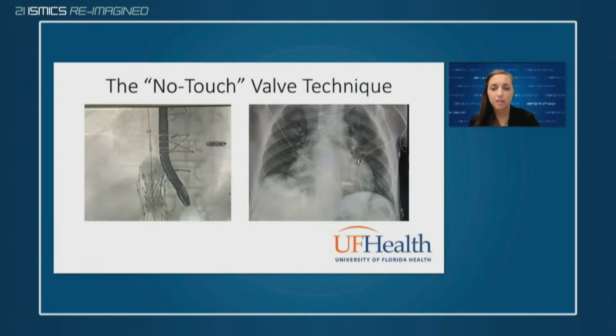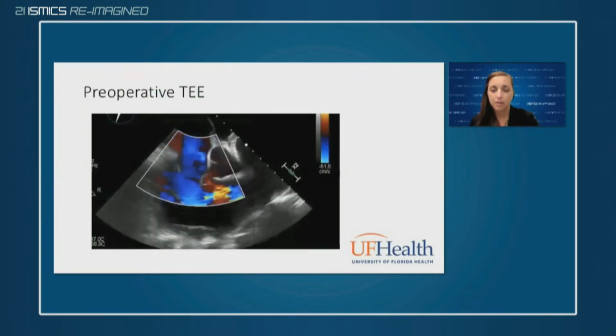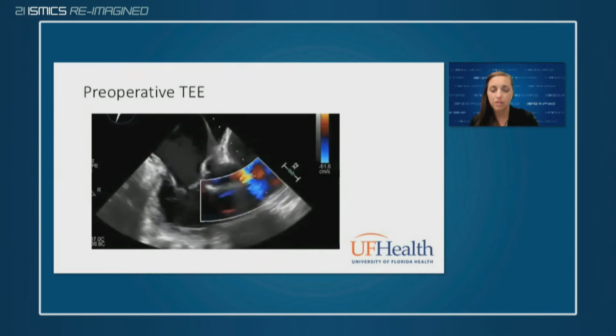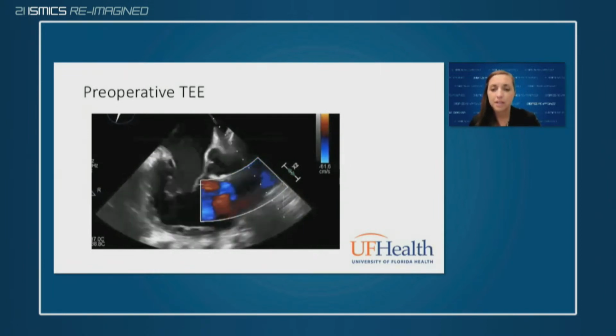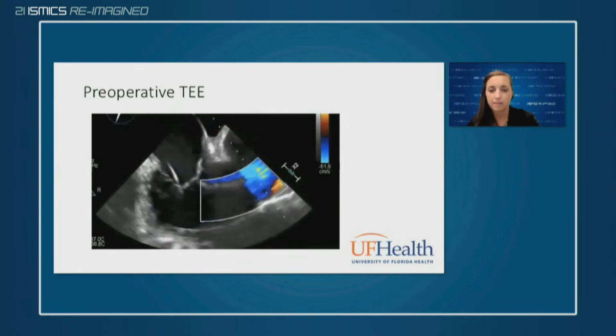The patients described underwent staged procedures, replacing the intracardiac leads with a microleadless pacemaker within the RV, as well as placement of a SAPIEN 3 transcatheter valve within Cook Z stents at the inferior cavoatrial junction. Our first patient is a 74-year-old male with severe symptomatic TR that developed after insertion of a permanent pacemaker. He was not a surgical candidate due to frailty and associated heart failure with an EF of 20%.